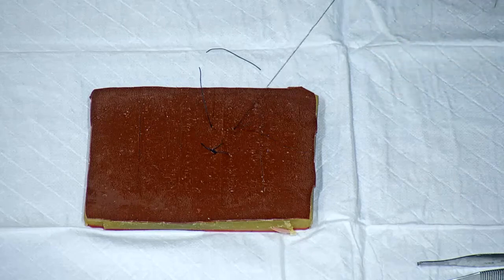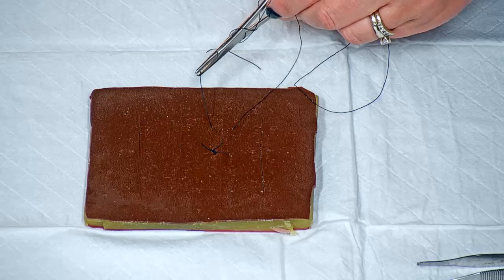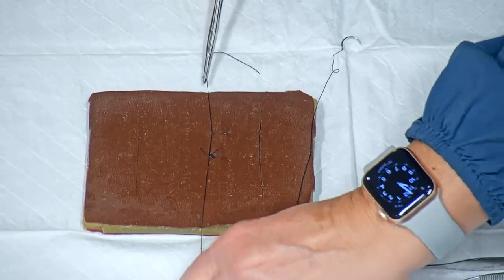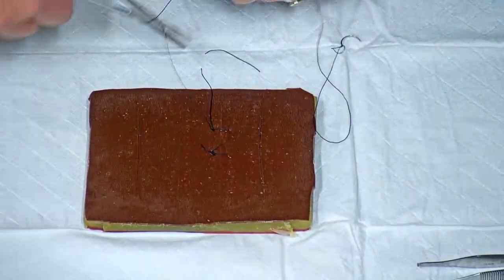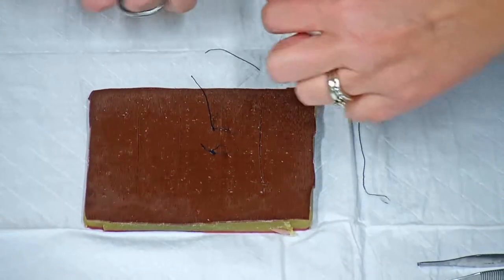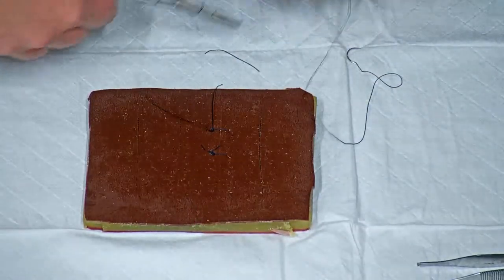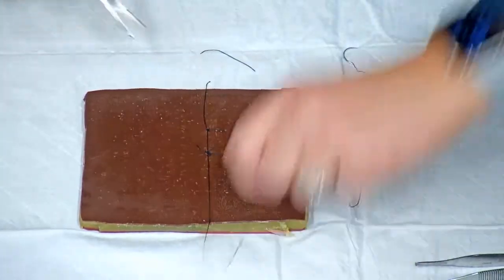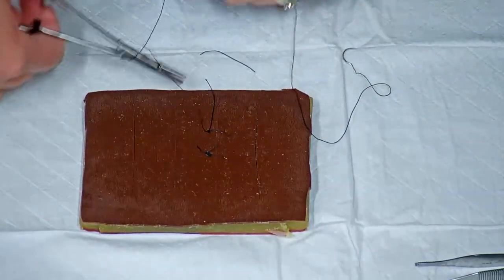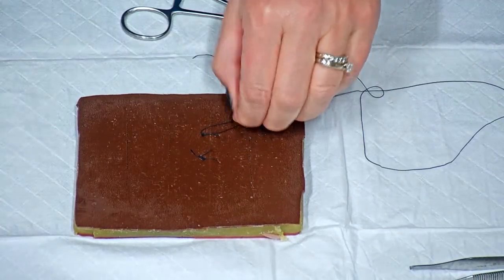drop your needle, 2 with that initial last loop, going to grab the tail, away, just until that skin is slightly everted, pull it back towards me, loop, away, towards me, away. Go ahead and take a little time to practice that.